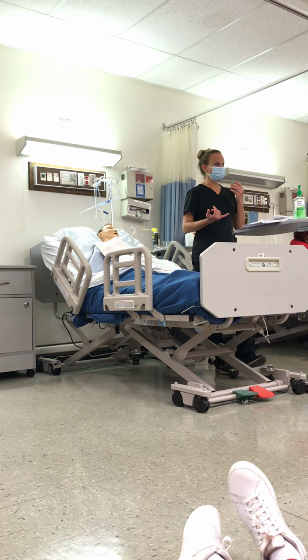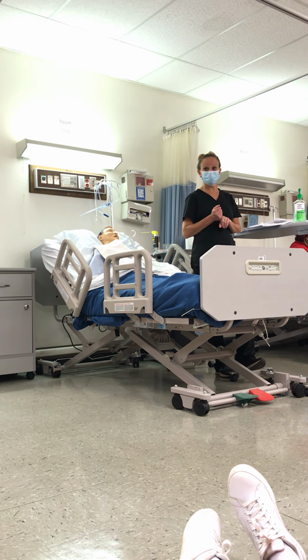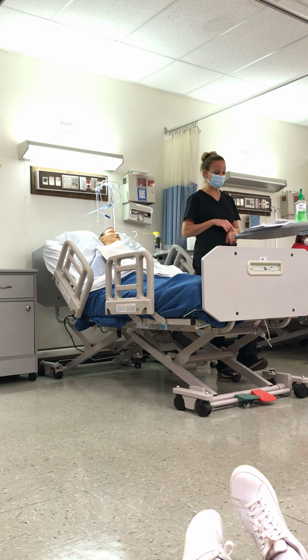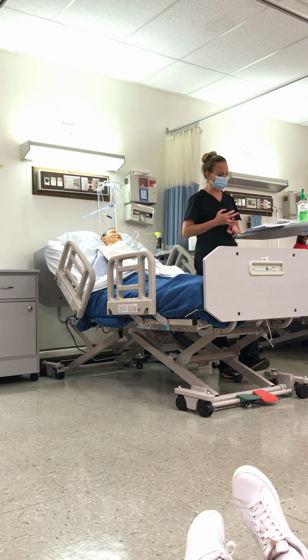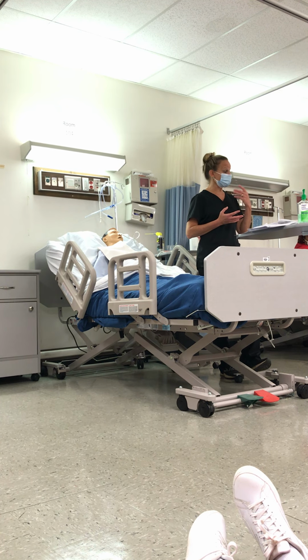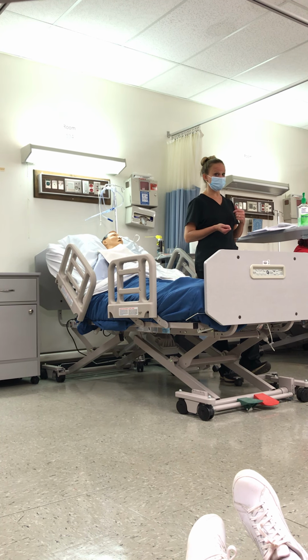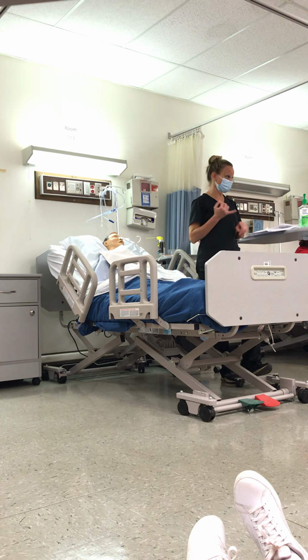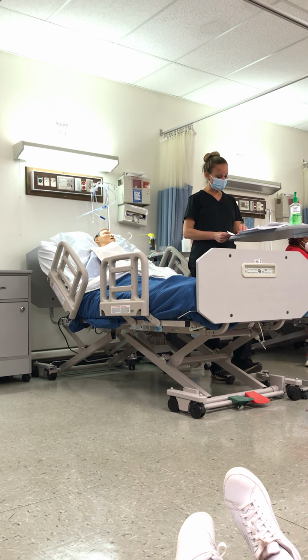Then you put how you know it's there. It was verified by aspirating the gastric secretion, auscultating over the stomach, and then you can say the color, because if it's in the lung and you pull back, sometimes you can get stuff depending on how bad off that patient is. It can either be blood or phlegm from the lungs.